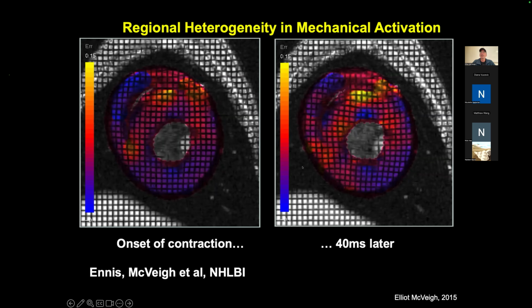Early on, actually at UCSD, some pioneering cardiac physiologists put these little tantalum screws into the myocardium, and then they would use biplane x-rays to watch where those screws went. So say you have 3 screws, and you look at the relative distance between all 3, and you can calculate the strain in that box.